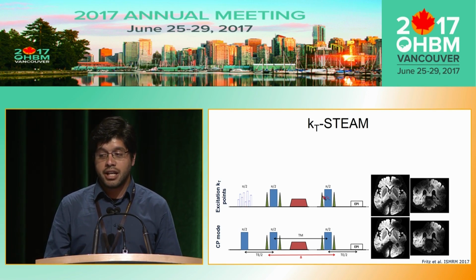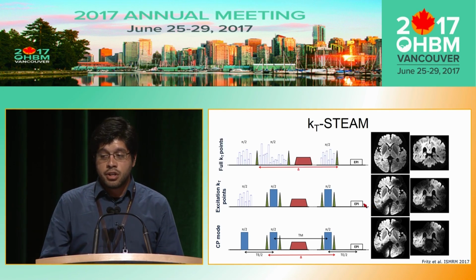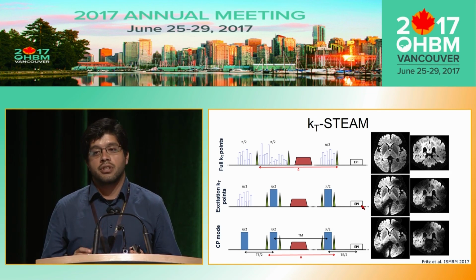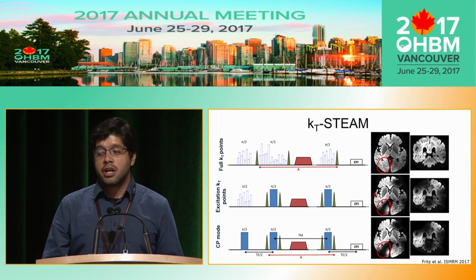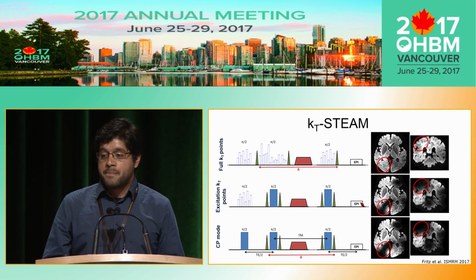Actually, it's not enough, and it's not much of an improvement, as you can see here. So it's necessary to extend these subpulses to all the pulses. And you can see here that we could recover the signal that was dropped out.